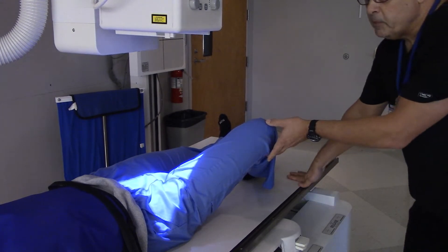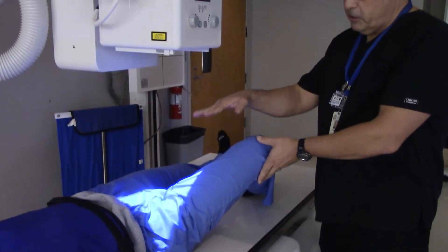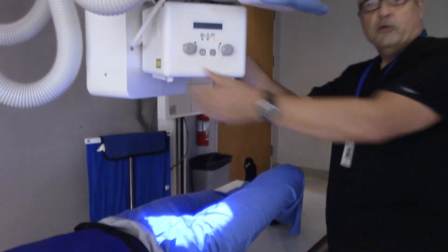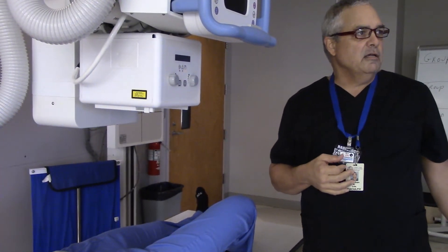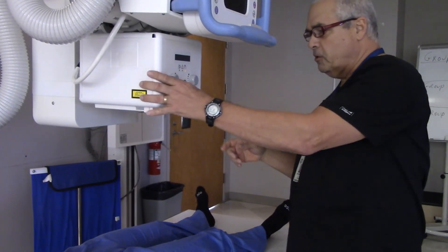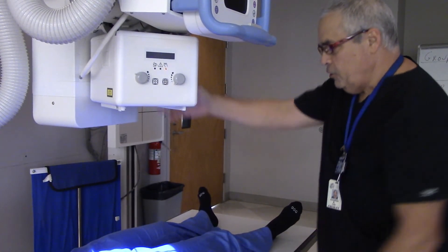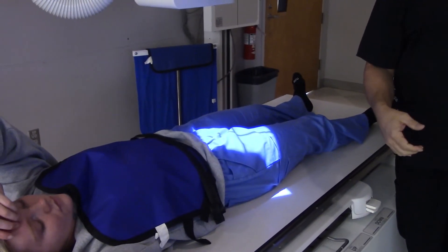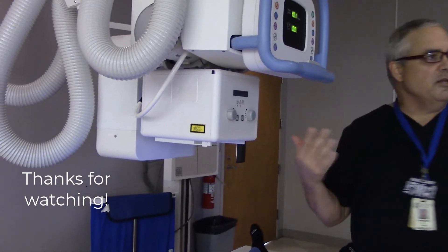The other thing I wanted to mention is some of my coworkers turn the collimator, but I don't really see any benefit in it, so I just leave my box like that. I guess if this was a male patient and I turned my collimator, you could argue that turning the collimator allows you to exclude the gonads, and it kind of does — so that might be a reason for doing that. Radiographically though, there's really not one.